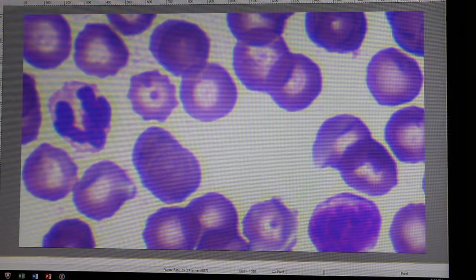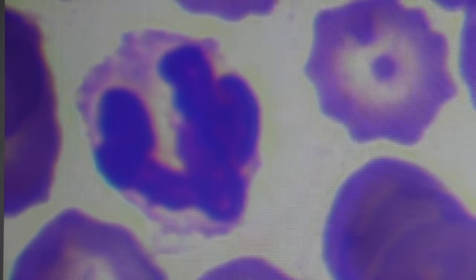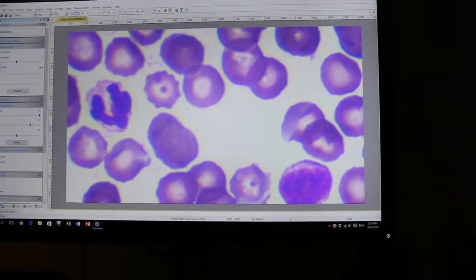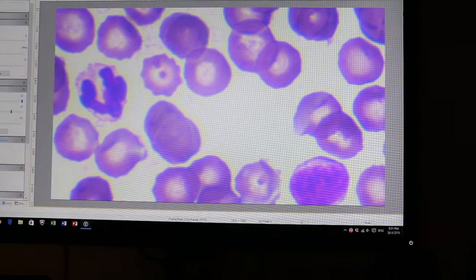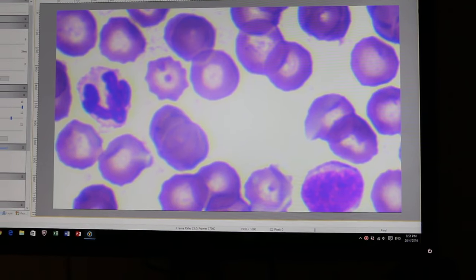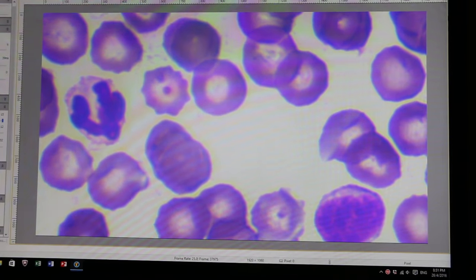out of the so many red blood cells, if you compare to the previous slide, I can only see about 2 RBC cells with infestation of babesia canis. There's this one being one of it, this is beside a neutrophil and there's another one here beside a lymphocyte. So, the dog definitely has recovered a lot and there's good news for the owner.